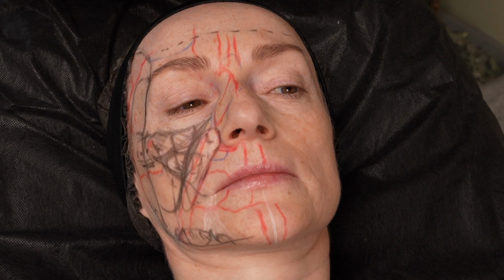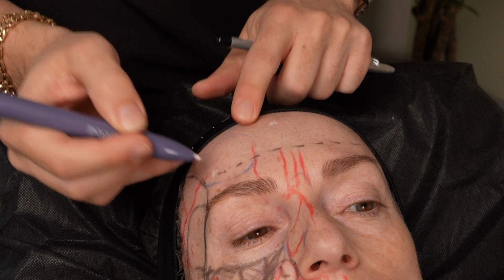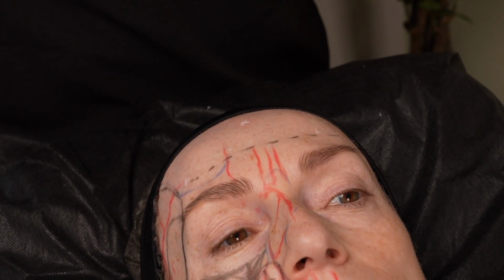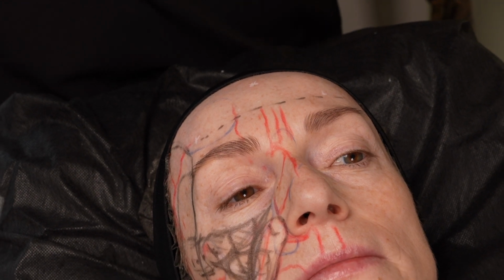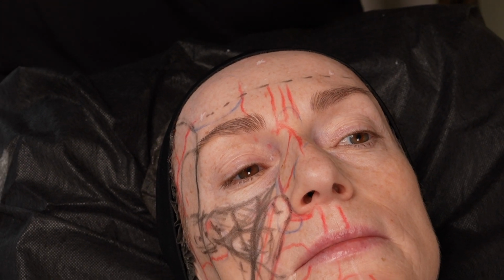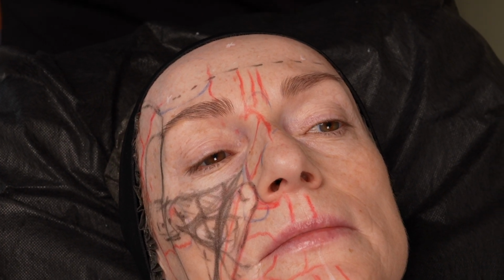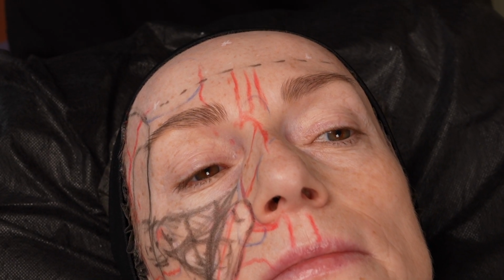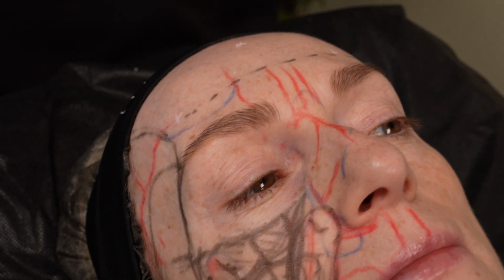Cannula, it's easier. You can open entry points from here. Laterally, you can open your entry points. But don't forget, open your way with the guide needle, touch the bone, then, like doing bevel down, open the way underneath the galea too. It's hard tissue. Then your cannula touches the bone, then you slide your cannula, and it's really tight tissue.